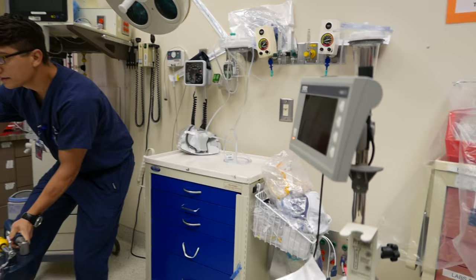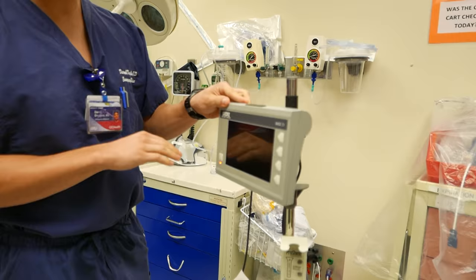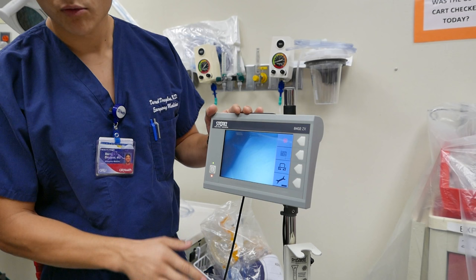We're going to do a video here today on how to set up your CMAC, and Daryl's going to give us some instruction. So we're going to talk about setting up the CMAC, which is a Storz device. This is our CMAC screen here, and the way you're going to turn this on is simply just that button there — that's going to turn it on.